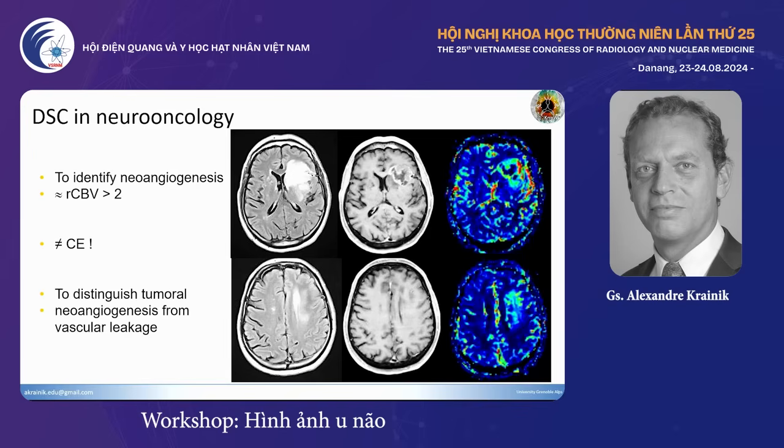And quite often, it's roughly linked. Usually when you see contrast enhancement, it's a combination of blood-brain barrier disruption and sometimes increased perfusion, but it's not always the case.